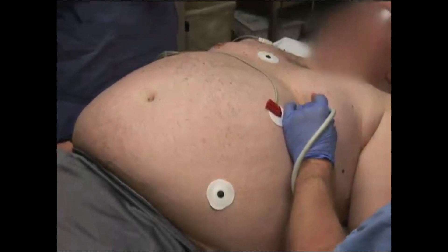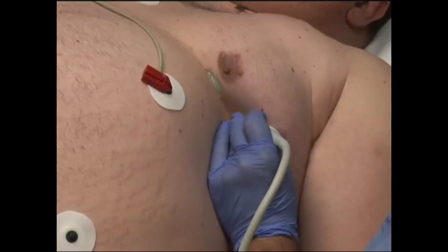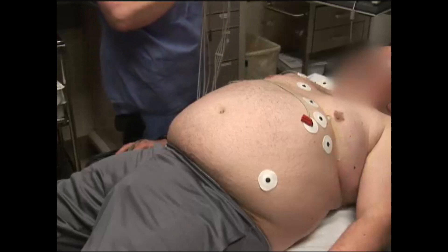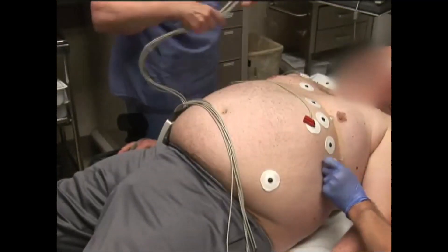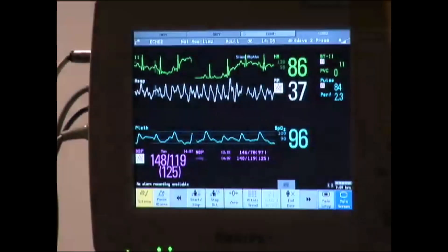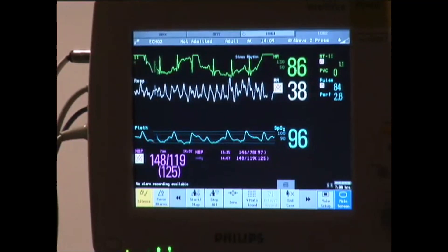The patient lies on the stress echo table and telemetry leads are placed on the patient's right and left shoulder and right and left leg. Telemetry leads should be placed to not interfere with image acquisition. The blood pressure cuff is placed on the arm and a baseline blood pressure is obtained. Baseline vital signs including blood pressure, heart rate, and rhythm are recorded.